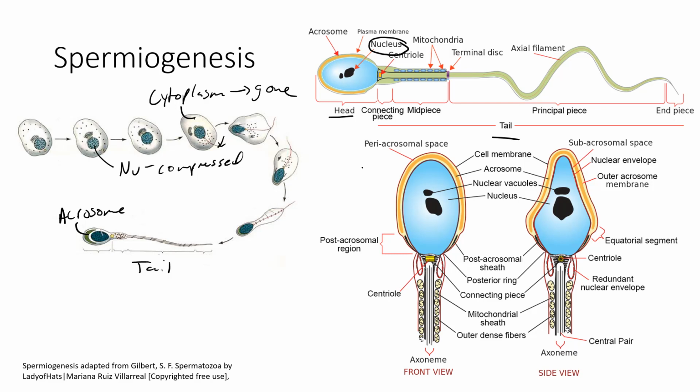That egg cell is well protected by a thick outer covering called the zona pellucida that the sperm cell is going to have to burrow through in order to fertilize the egg. Fortunately, the acrosome, which we saw down here, contains enzymes that will help break down that zona pellucida, allowing the sperm cell to penetrate the egg cell. We also notice that the midpiece here that kind of connects the head to the rest of the tail contains numerous mitochondria.